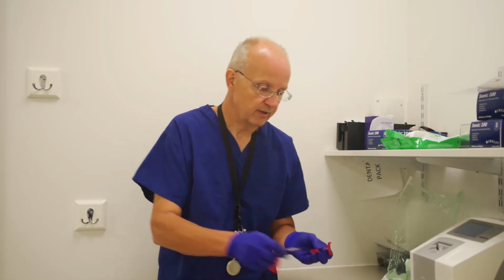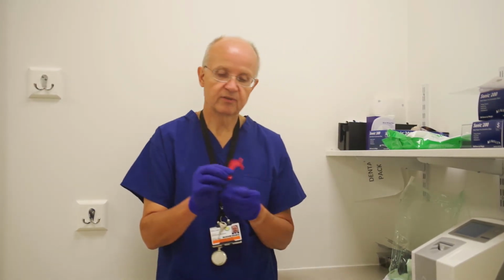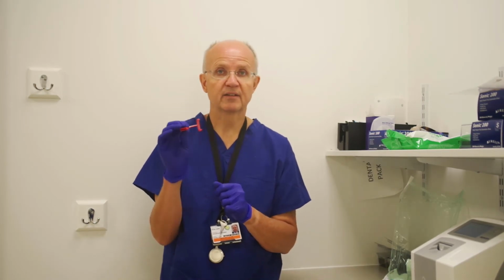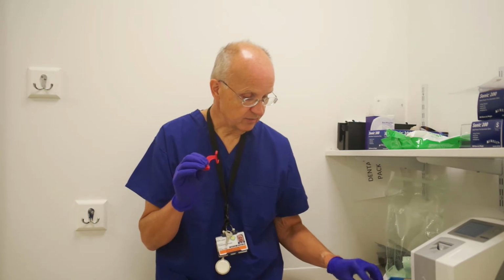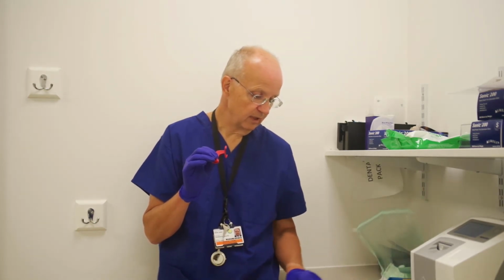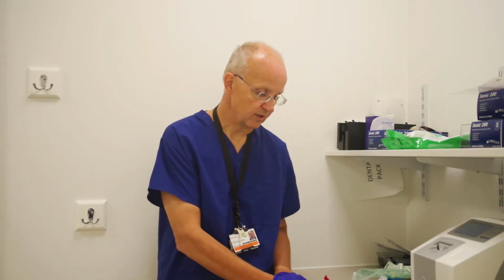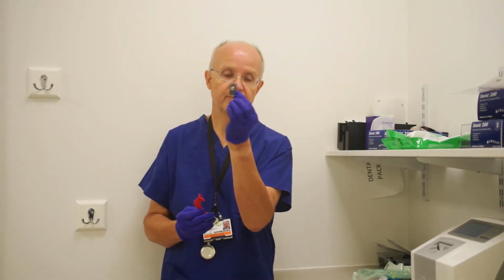Okay, let's just look at the bite guides here at the end. Because they grip at the top and the bottom, we have to have different size ones for adults and children. For adults we're going to use a size 2 film, which is this one, and for children we're going to use a size 0 film.